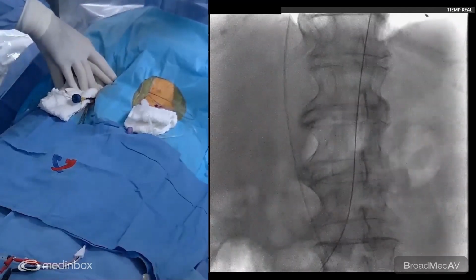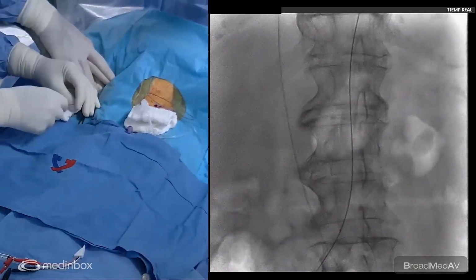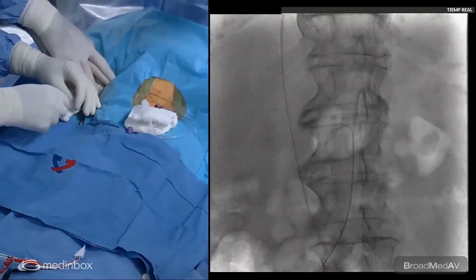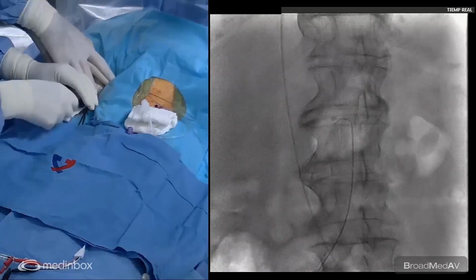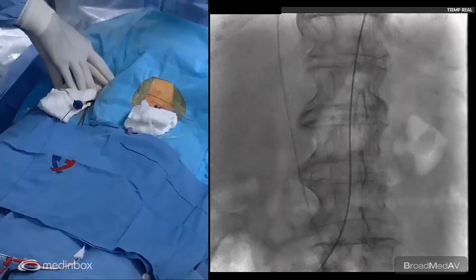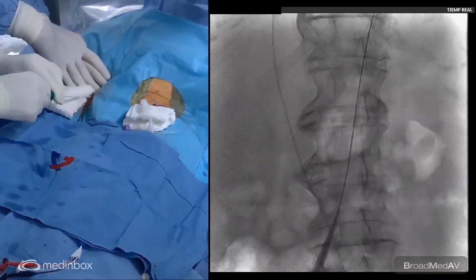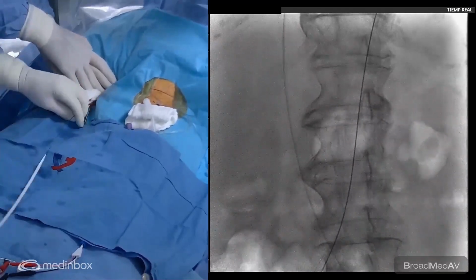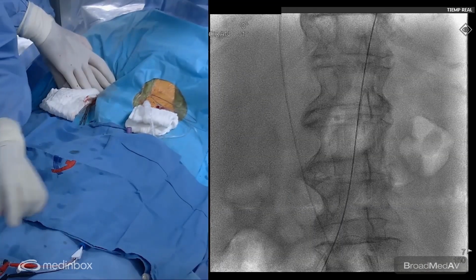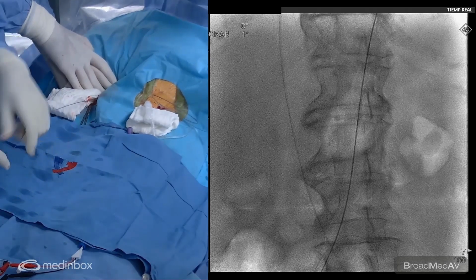So this is very important, whenever we use a large bore introducer, it's important to use a hard wire, extra support wire. So this is also our practice to be sure that we don't have any problem. Okay. So we have dilated the skin and the orifice. And now we put the introducer, and also Fernando recommended us to suture to fix.